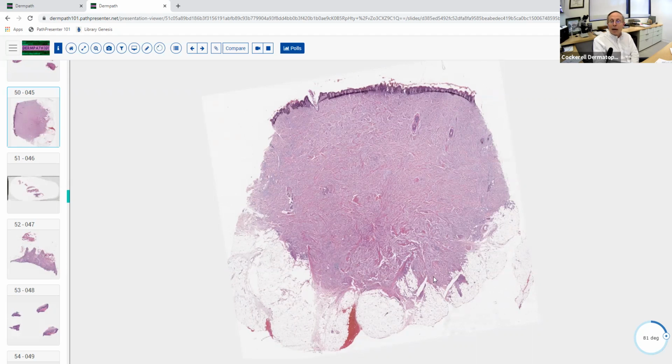let's look at the bottom, and you can draw a kind of circle around it. It doesn't have a jagged, irregular appearance going way deeply into the subcutaneous fat. So it favors benign when you see this pattern. What kind of differentiation is it exhibiting? Is it epithelial or non-epithelial? At least at this power, it's maybe epithelium, but we're not sure. It might be squamous. We're not really positive at this point.